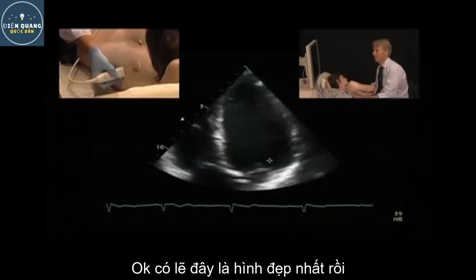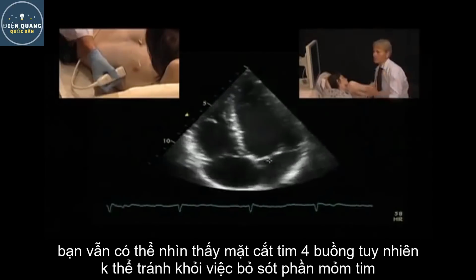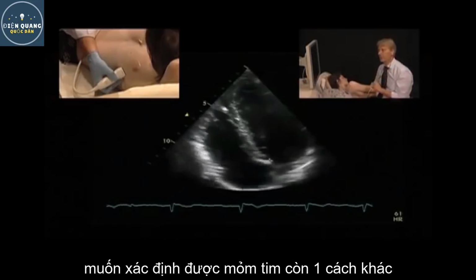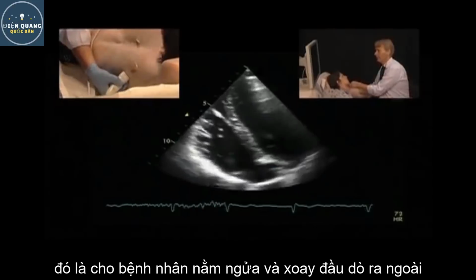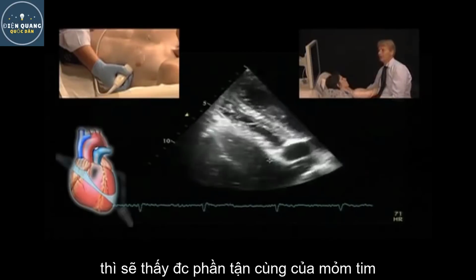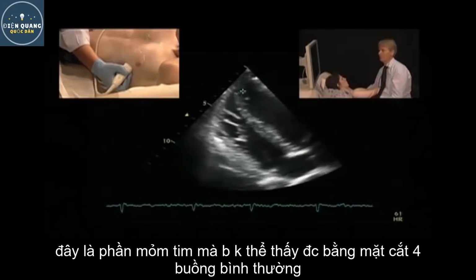Okay, this would probably be a better view. So this is much less foreshortening. Of course, you cannot avoid that you miss some of the superapical views, but this is certainly better than what you've seen before. If you really need to see the superapical views, there's another trick that you can use, and that is by bringing the patient more in a position on the back and rotating the transducer very, very laterally, and then all of a sudden you will get views which are very atypical, but which do show you regions of the apex that you cannot see with even the optimized four-chamber view.